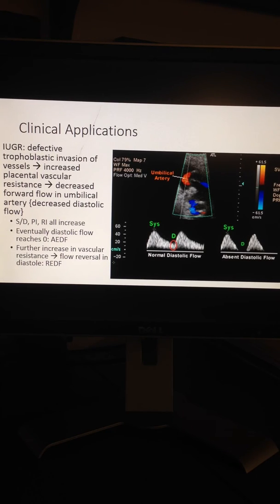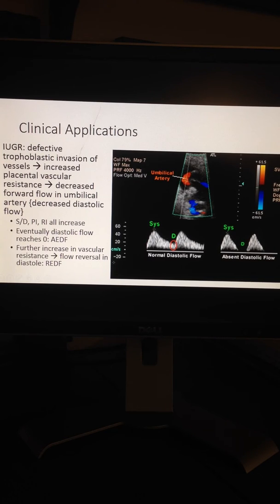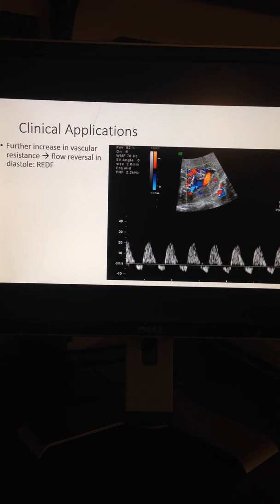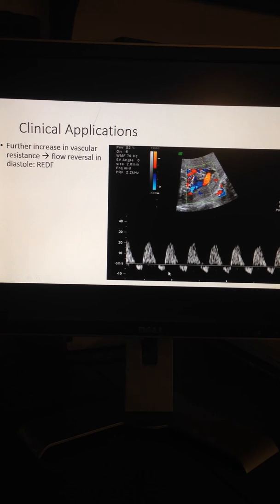The umbilical artery Doppler has a characteristic sawtooth appearance of arterial flow in one direction and umbilical venous flow in the other. With IUGR, there is defective trophoblastic invasion of vessels that leads to increased placental vascular resistance and decreased forward flow in the umbilical artery. With additional compromise, the diastolic flow approaches zero, and this is called absent end diastolic flow. Here is an image showing reverse end diastolic flow.